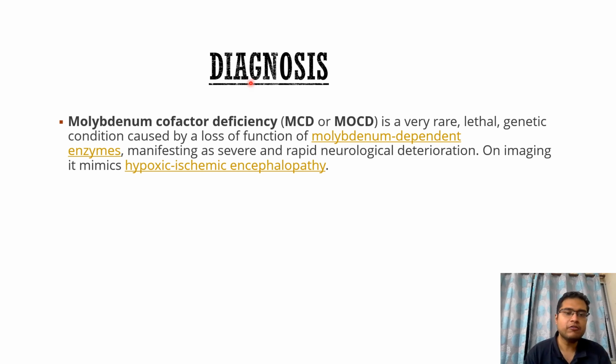So it's actually a case of a molybdenum cofactor deficiency, which is a rare lethal genetic condition caused by a loss of function of molybdenum dependent enzymes manifesting as severe and rapid neurological deterioration. On imaging, it mimics hypoxic ischemic encephalopathy completely. So this is another entity that has to be remembered. All these are rare entities which I am showing you, but the important thing is these have to be kept in mind along with the common ones that we are reporting on a daily basis.